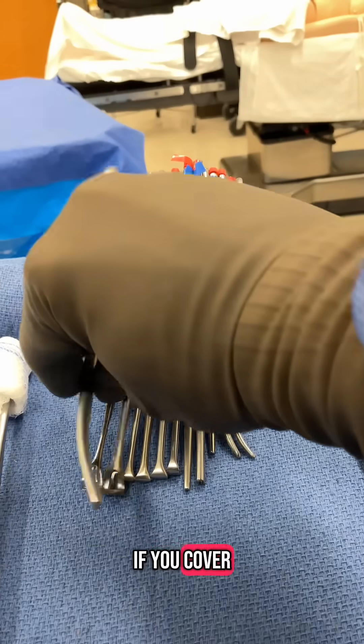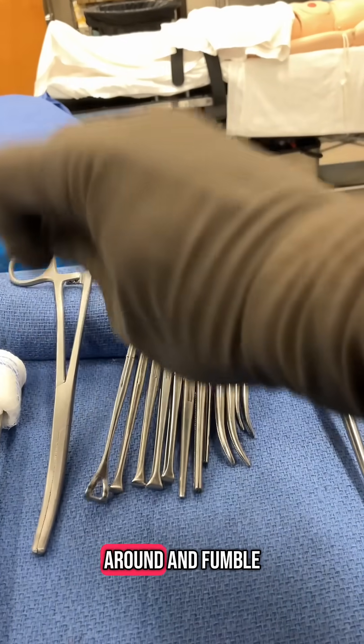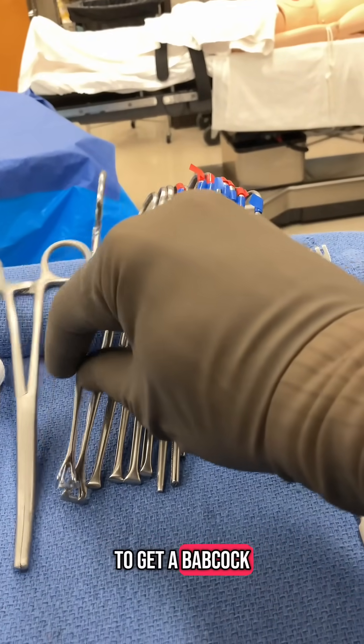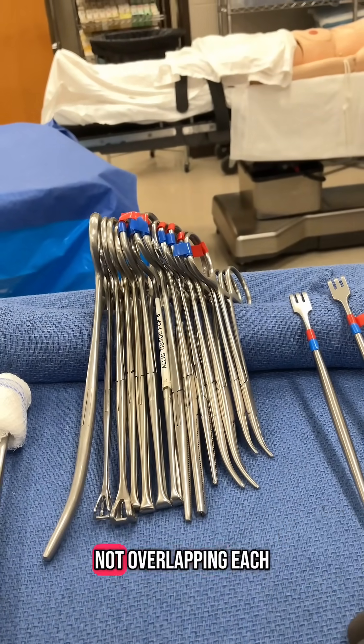If you have things piled up and someone asks for a Babcock, now you've got to move stuff around and fumble to get it. So you want everything sitting up straight and evenly spaced, not overlapping each other.